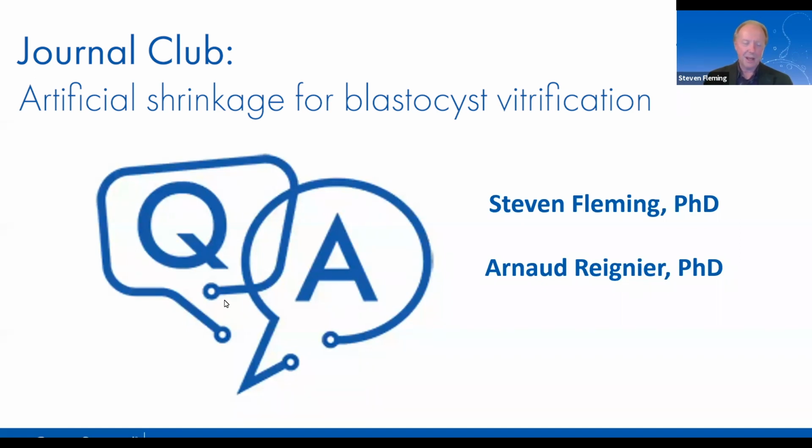Yeah. And from the studies that you've looked at, which method do you think is best for blastocele collapse, the laser or the mechanical artificial shrinkage? So I really think that laser pulse is the most efficient technique, and that it is not damaging the embryo. In some studies comparing the two techniques, they had really better results with laser pulse than with mechanical. And in fact, this might explain one of the results, one of the studies included in your review.